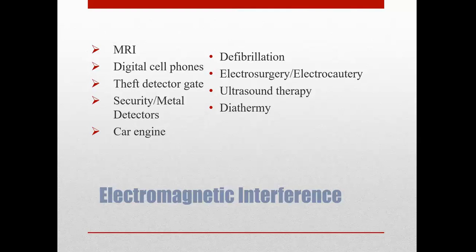So it mentioned on there electromagnetic interference. Patients who have pacemakers typically can't have MRIs. Most of them are not compatible. It's also important that patients be aware of electromagnetic interference in their homes.